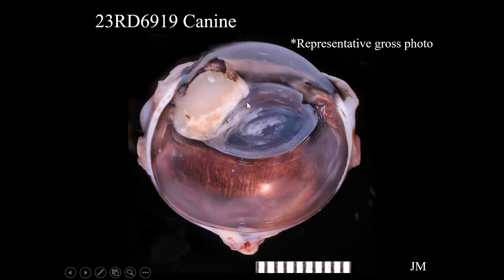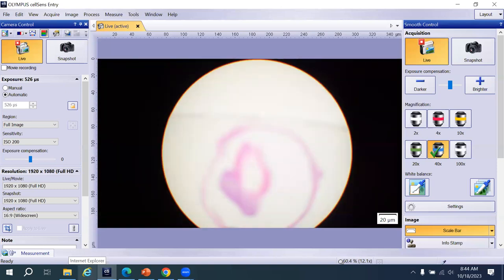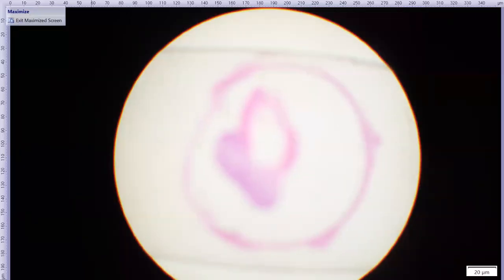So we can see that there was indeed a ciliary body mass here, kind of sitting right in here between the iris leaflets, and it hugs the lens. And there's not a whole lot else going on, grossly. And then we can see the same thing on our subgross view of the globe. Here, the mass is a little bit artificially separated. You can kind of see where it would have been sitting right here, kind of lining the ciliary body and the iris. And again, hugs the lens.